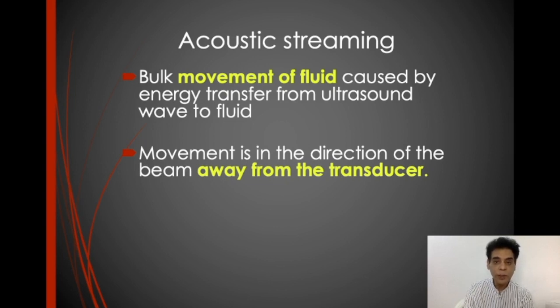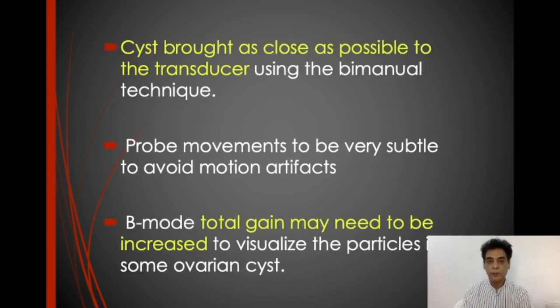Now, this is movement of the particles within the fluid, and this is caused by the energy of ultrasound beam. So this energy of the ultrasound beam is pushing the particles towards the base. So the movement is away from the transducer. Now, in order to elicit this technique, it may not be seen in all the cystic masses of cystadenoma or acute hemorrhagic cyst or so, but whenever it is seen, it is helpful.